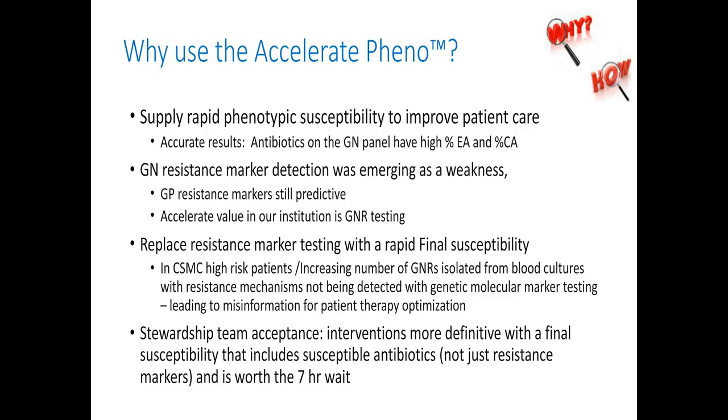We did not do it in that way because we were actively using another system for gram-positive markers. In our institution, the gram-positive markers had been used for years and were used successfully. However, in some institutions, that might not be the case with resistance marker testing.